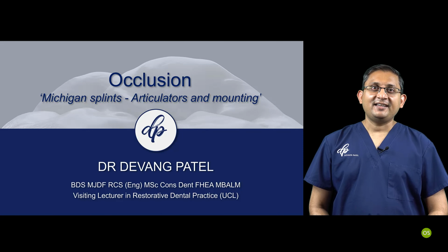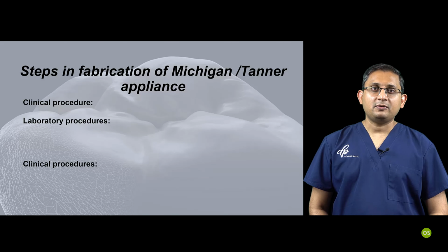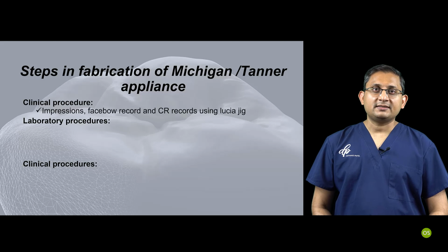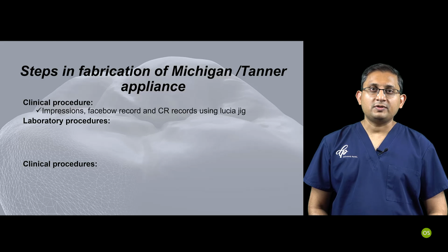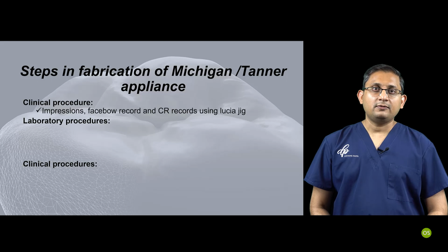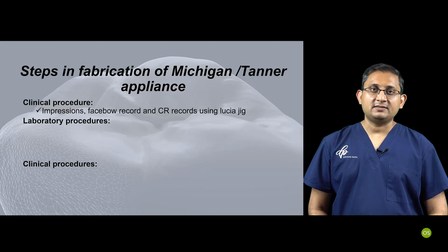Hello again. In this video, we will discuss various articulators and mounting procedures. So let's recap. We discussed various clinical procedures you need to do in order to fabricate a Michigan splint. We discussed the importance of taking good impressions, various ways you can take face-bow records, and take interocclusal records in CR for fabrication of Michigan splints.